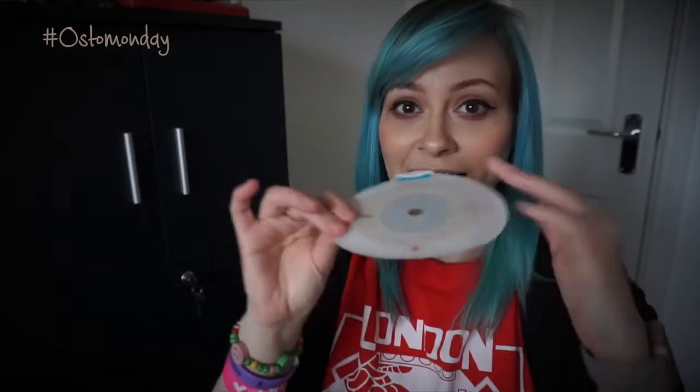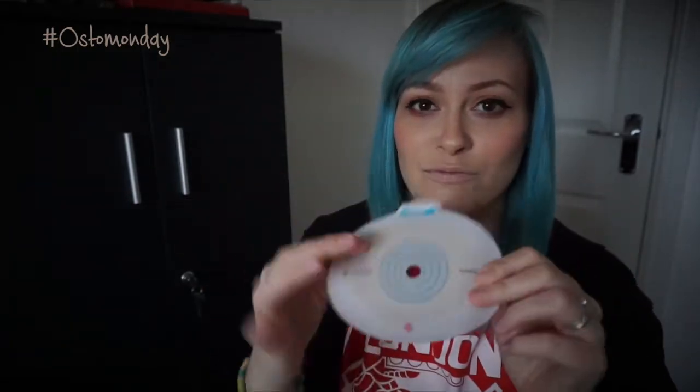So this is just like a normal base plate. It's completely flat — there's no kind of raise in the middle. This is like your standard appliance, what you tend to be given first as the first version of appliance you have.